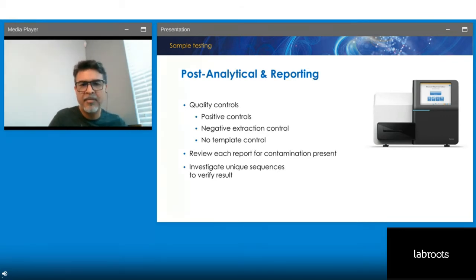So this is a very strong and robust process, not only from the moment that the specimen arrives, but during the analysis and in the bioinformatic pipeline. The whole process is to guarantee that for the specimens we receive for NGS analysis, the results we are reporting are actually from organisms present in the specimen. Those organisms were not introduced at any point during the pre-analytical or analytical steps, and there wasn't any error in the bioinformatic pipeline. So the laboratory needs to provide an accurate, reliable result, trusting that the samples received are high quality and the organisms present are clinically significant.